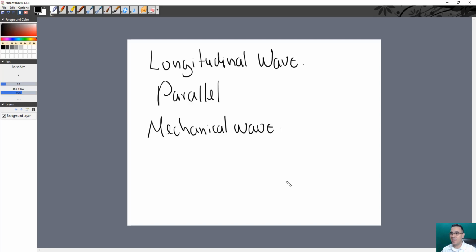That's good to know. So until now we have that ultrasound uses frequencies above 20 kilohertz, or above the audible range. The imaging range goes from 2 megahertz to 21 megahertz. Mega, that's a million, so 2 million hertz, that's a lot. That's the frequency range for imaging. And we say that if the frequency increases, then the resolution is going to increase, but the penetration is going to be compromised.